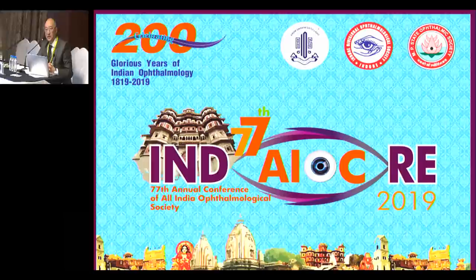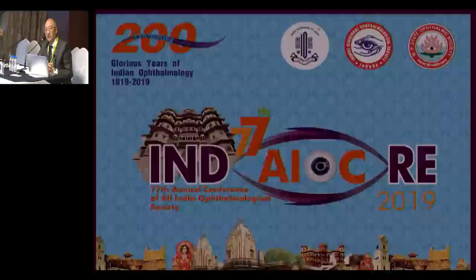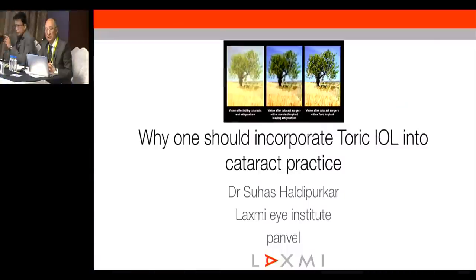Whatever we have used, the distance visual acuity and the near and intermediate are very good. And the contrast for these patients is also far better than the bifocal lens that we had in our practice. I think we have to shift to trifocal lenses. And as rightly said, once the toric has come up now, things have become much more comfortable. We can accept these lenses for a wider range of patients with the toric platform also.